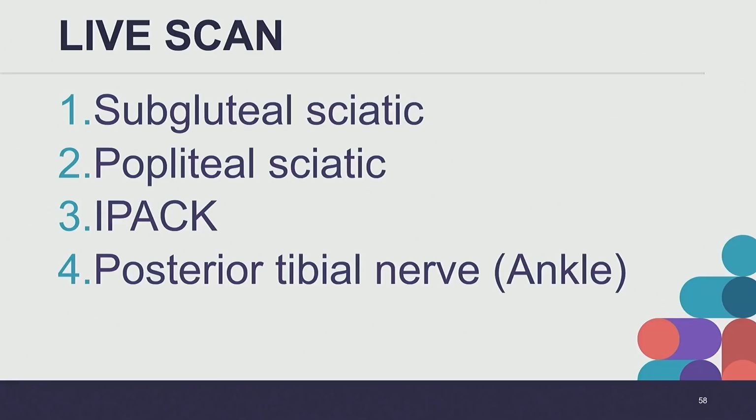If I scan up towards the leg, it starts to become a little bit more apparent. Yeah, that's great. So 3 to 5 cc's is all you need, and you have complete plantar foot anesthesia there.